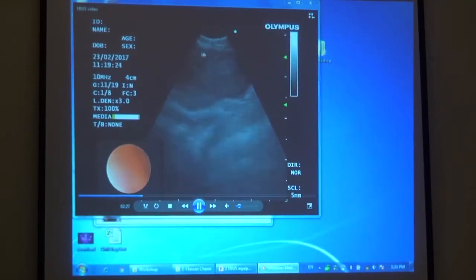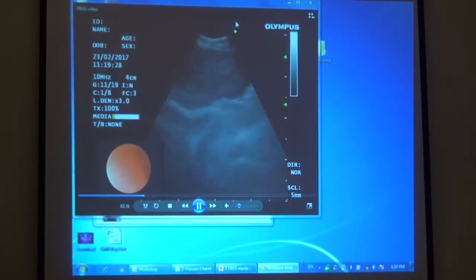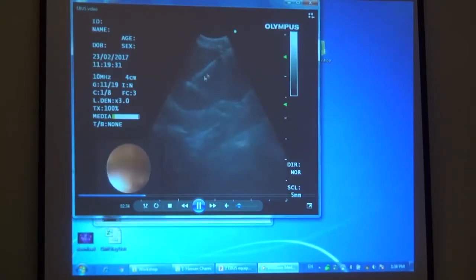You can see the interface is circumscribed, and there's a blood vessel here. And the needle is going to come out from here. So you jab it. You don't try to push it. And then you move your wire inside. If you see this movement, that's the wire being moved. Sorry, the stylet or the wire. So this movement is the stylet being moved to get the debris out. And you maybe see the debris here. And then you move your needle in and out.